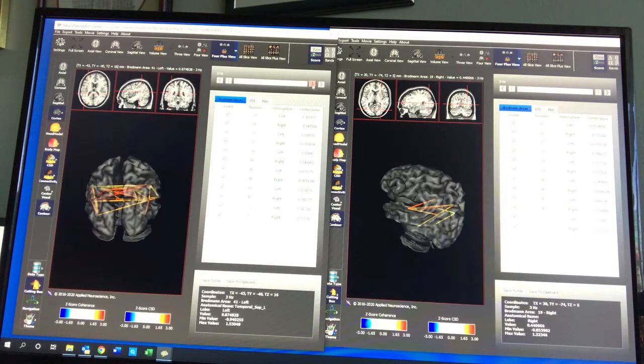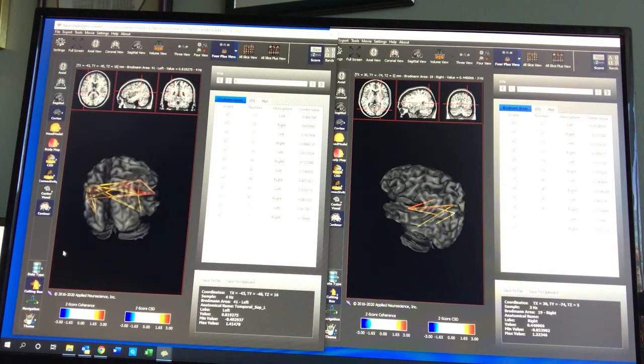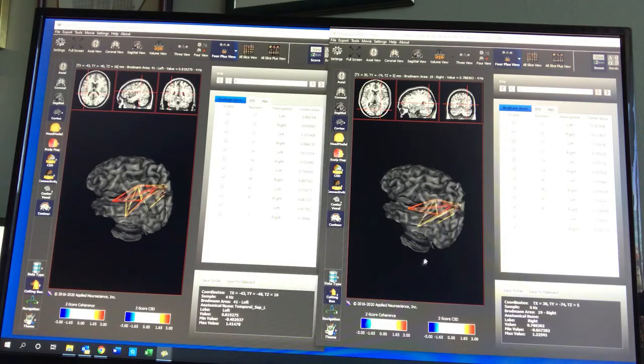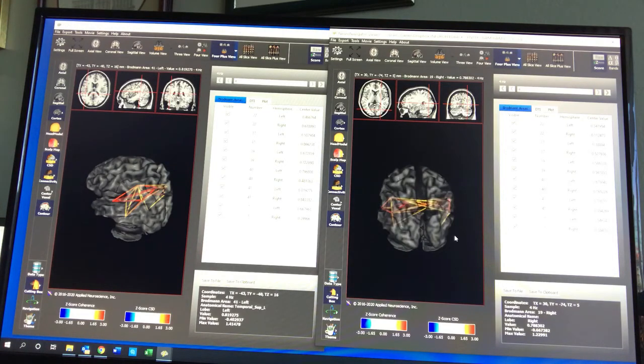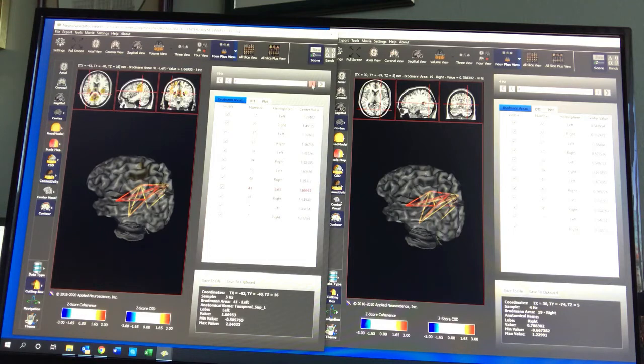Let's see what's happening at 4 hertz. 4 hertz, a lot of inefficiency in the brain in terms of the aphasia problem, the inability to speak her words, to be able to communicate. When we look at it 10 sessions later at 4 hertz, we see a lot is still there. So here's where we begin to see that we got some activity change at 1, 2, and 3 hertz, but when we get to 4 hertz, we're seeing still areas and frequencies where we need to do more work.